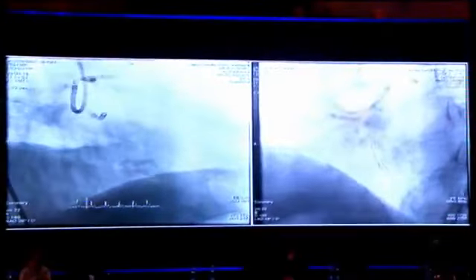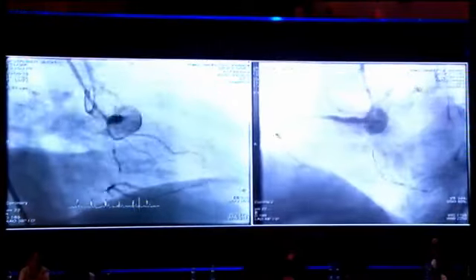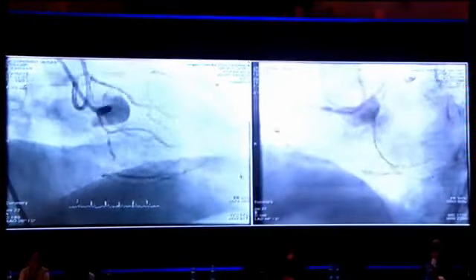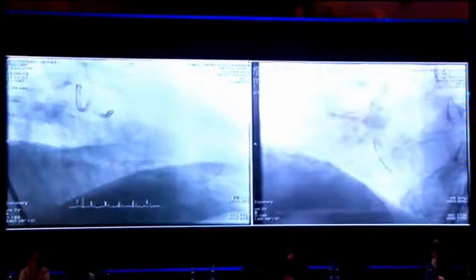Yeah, we understood from your case that we saw there's RCA diffuse disease and the CTO in the distal RCA. And you tried to fix the LAD, leaving the septal to approach for the retrograde approach.